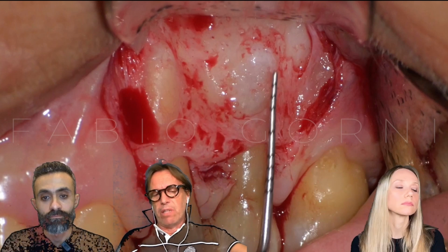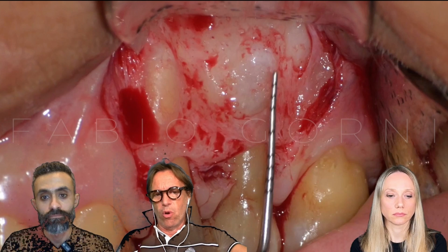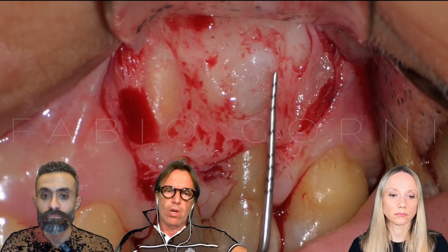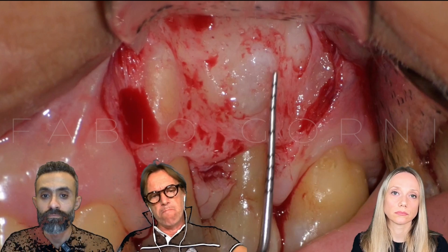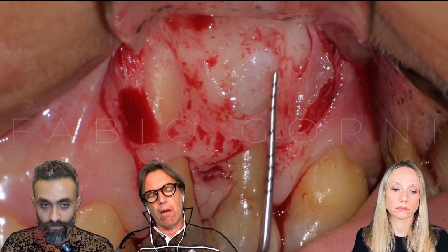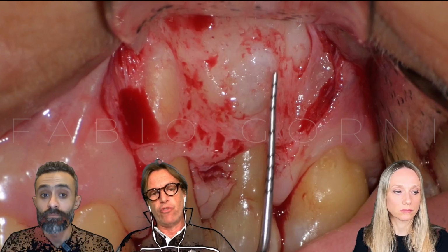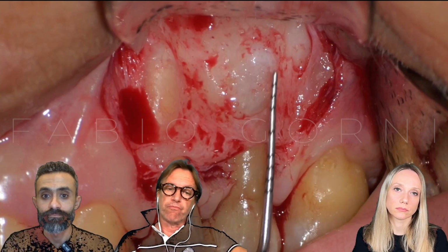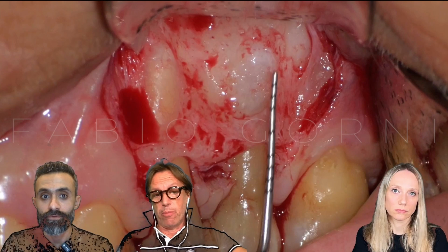When sometimes the mental foramen is so close to the apex, in that case probably it's better to make a notch in the cortical bone just to fix our periosteal elevator, for example.